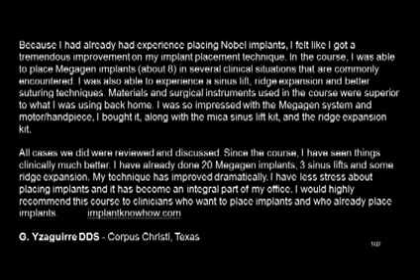I was so impressed with the Megagen system and motor/handpiece, I bought it, along with the Mika sinus lift kit and the ridge expansion kit. All cases we did were reviewed and discussed. Since the course, I have seen things clinically much better. I have already done 20 Megagen implants, 3 sinus lifts, and some ridge expansion. My technique has improved dramatically. I have less stress about placing implants and it has become an integral part of my office. I would highly recommend this course to clinicians who want to place implants who already placed implants.